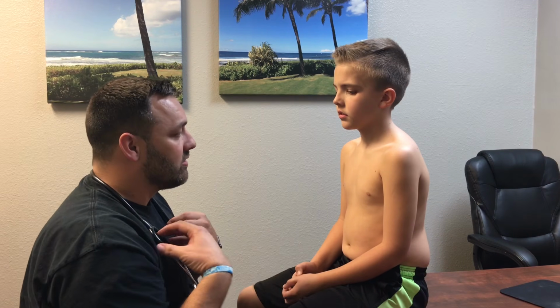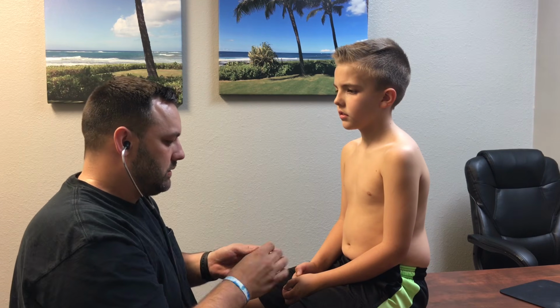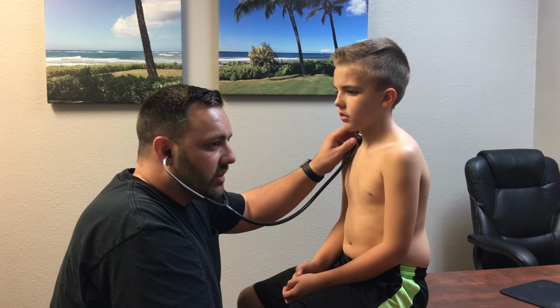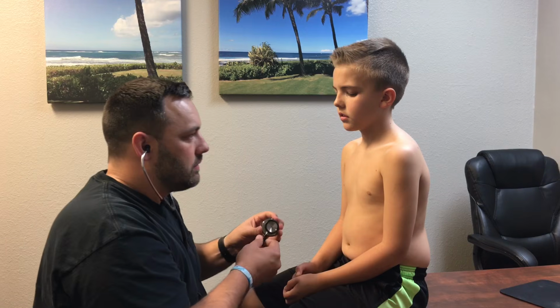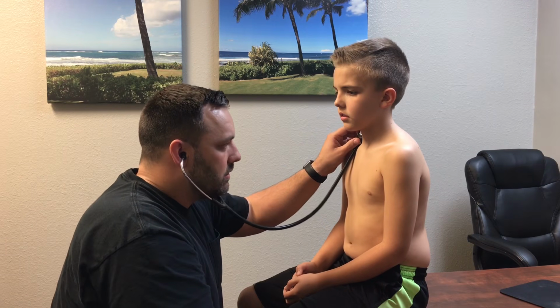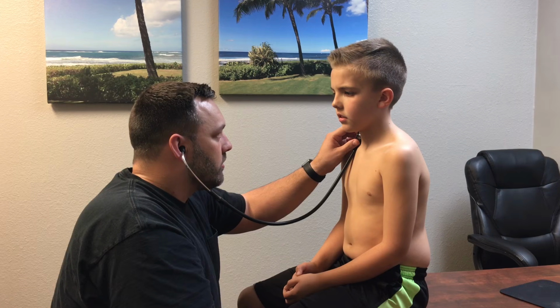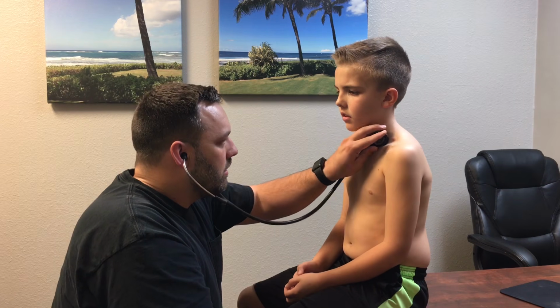Before I do that, I'm gonna listen. I like to palpate last, so I'm gonna go ahead and listen to his lung fields. Inner 1/3 of the clavicle, I'm going to use the bell. Take a deep breath every time that the stethoscope touches your skin, okay?